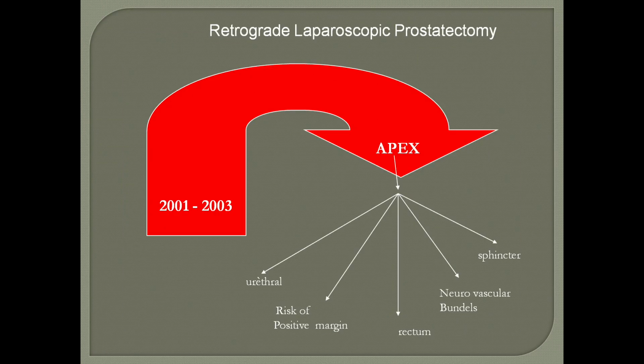So concerning the strategy, when we were doing the open prostatectomy, it's a vertical view, so it's logical to start by the apex and to do a retrograde prostatectomy. I tried to do this surgery in 2001, because I started in 1998 when Richard Gaston described the first approach of the seminal vesicle, but I had some trouble, and I stopped for 2 years, and I went back to open for 2 years, thinking about this technique. And then I said, oh, perhaps it's possible to do the radical prostatectomy by the same approach, retrograde.